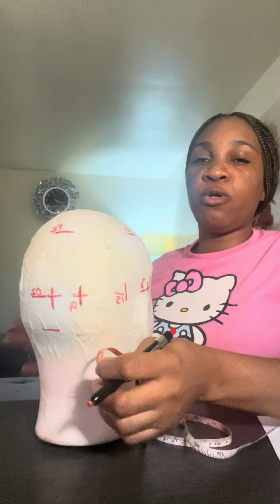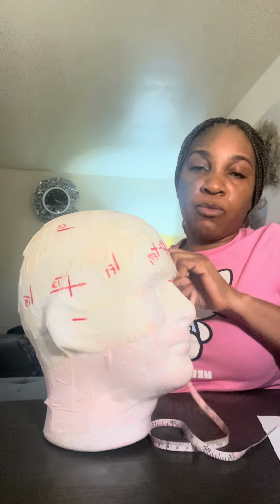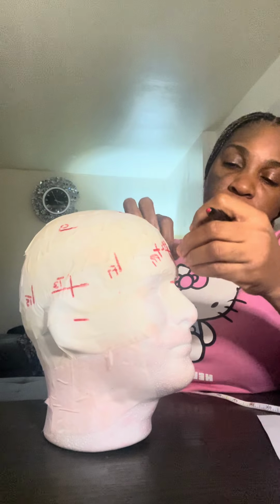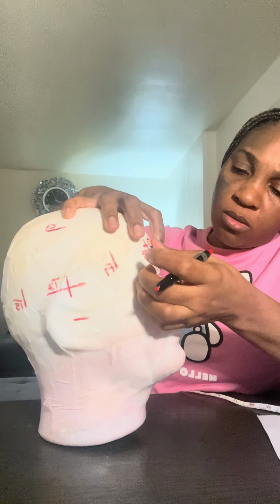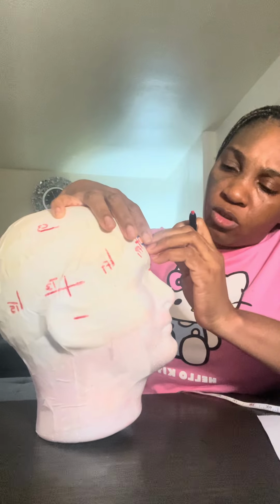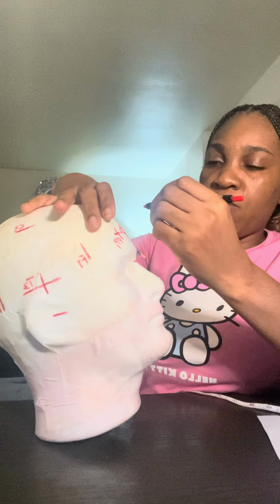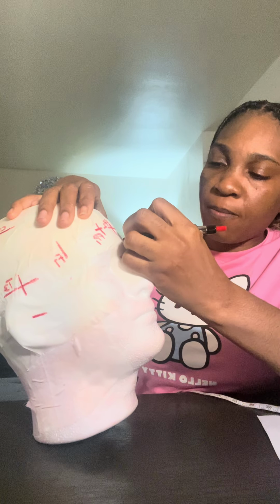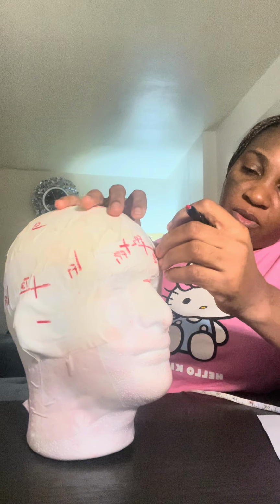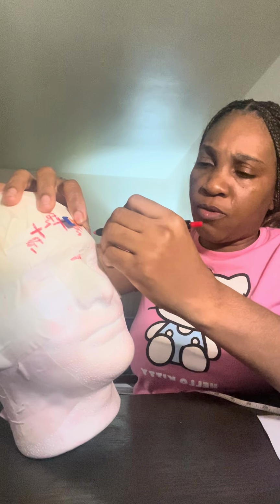All right. Now I'm going to go back front to my FP2, FPZ. Putting my tape on my FPZ, going to T4, 10%, which is 2.7. This is going to give me my true FP2. All right, now putting my tape on true FP2, going to T4, 20%, 5.4.